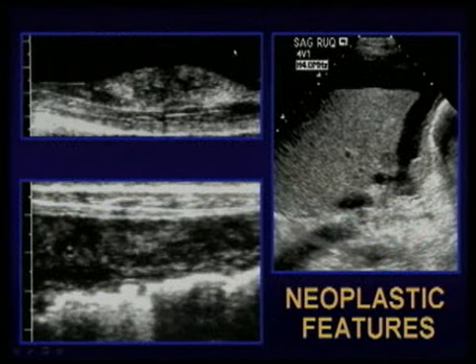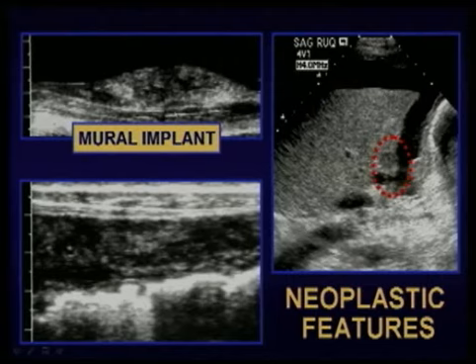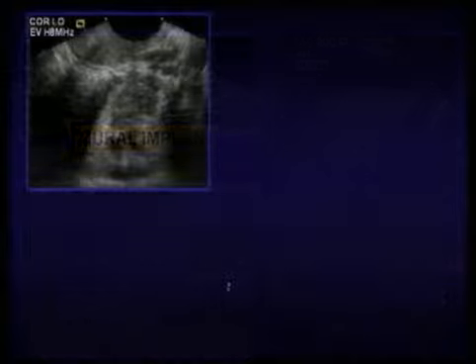So here we have a case where there is ascites, and there was an ovarian mass, to give you the opportunity to evaluate it further. Change your transducer now to a superficial transducer and realize that you're dealing with an implant here in the peritoneum itself. Or go to the outside of the liver here, the periphery of the liver. That's where tumors like to go, the periphery of organs. So that is a tumor implant in a lady who has a small ovarian cancer. And here we also have a peritoneal implant in addition, so that patient has both. Here we have omental thickening with bowel displaced away from the abdominal wall.